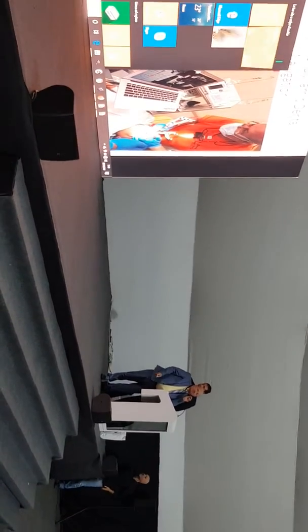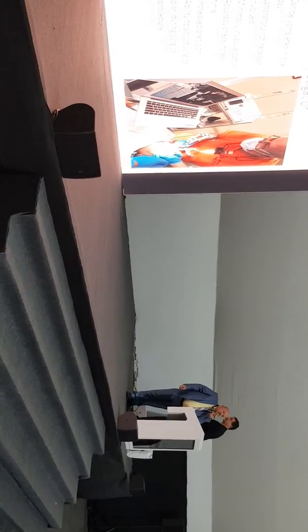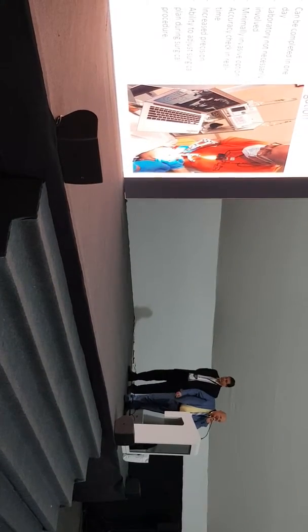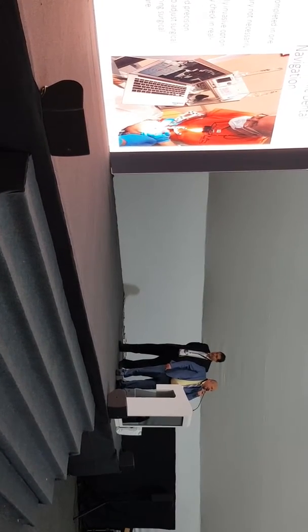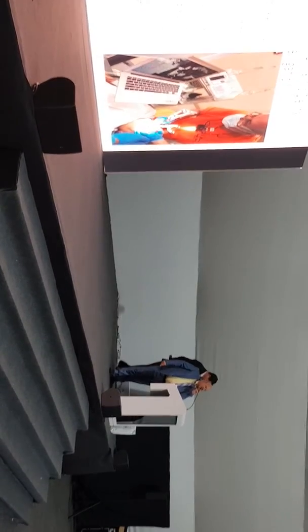Sometimes using static navigation we are obliged to follow the plan, but sometimes we find while working that we should change our plan. With static navigation we cannot. Here we can modify our plan during our work.